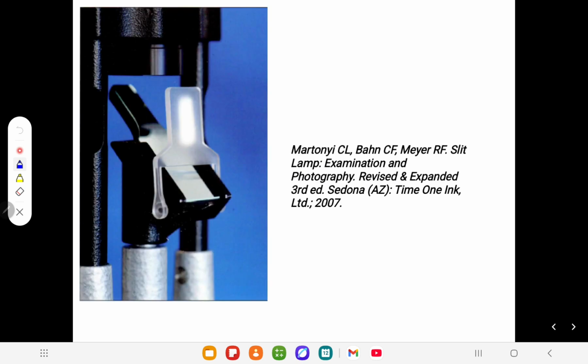So what do you mean by that? I think you have seen such a thing in front of the mirror in any slit lamp. Just try to understand this. This type of filter, this type of glass, will help to diffuse the light. You will see this type of lamp. Very rarely we use it, but yes, we use it sometimes, especially for photography, for a general rough idea.